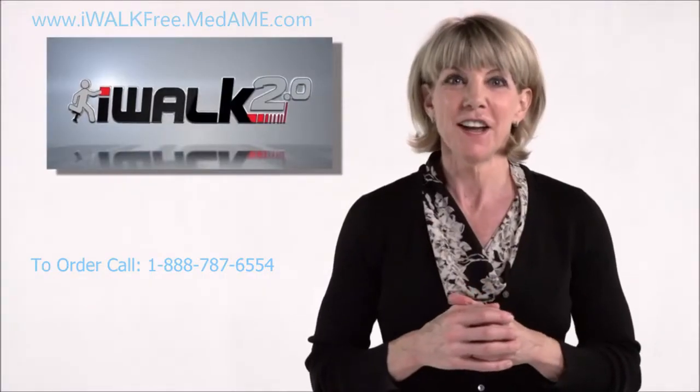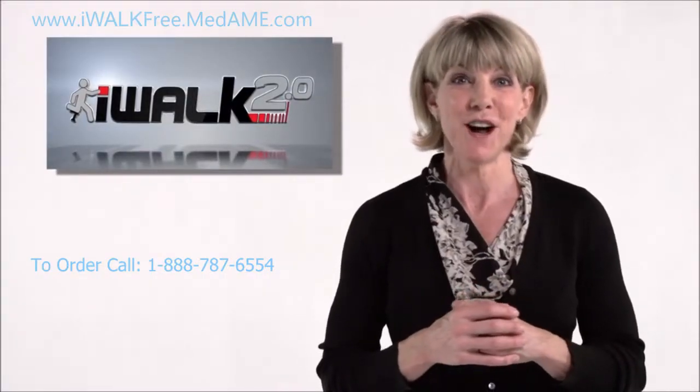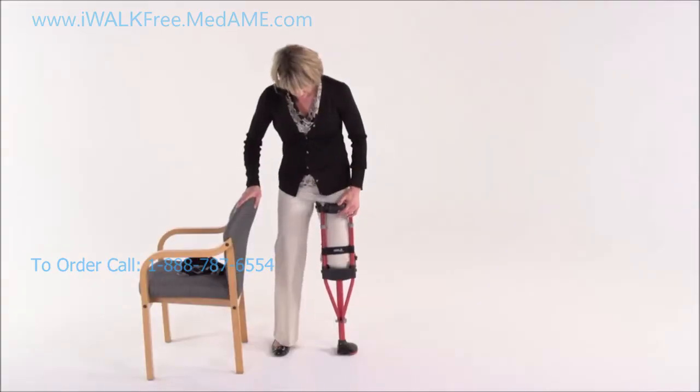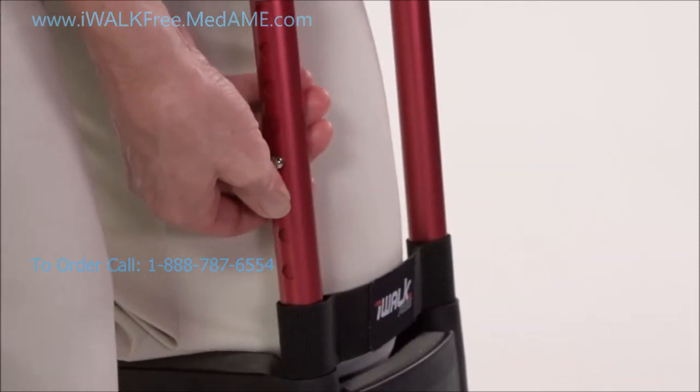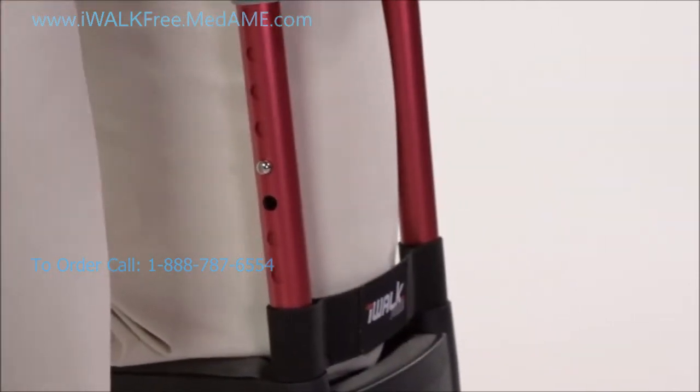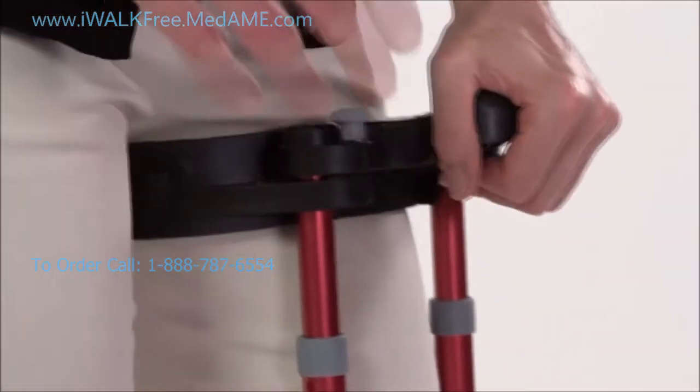Keep kneeling on the crutch and now we're going to adjust the upper section height. The goal is to have the thigh supports as high as possible on your leg, so push in the spring button head while pulling up or pushing down on the handle until you have the correct height.